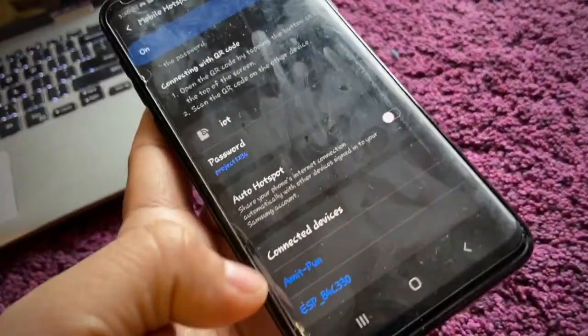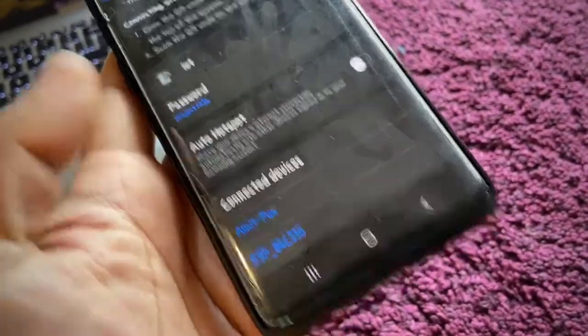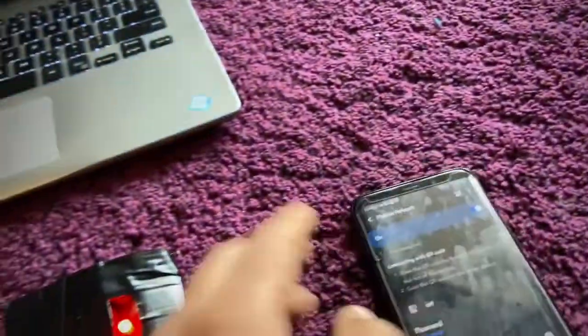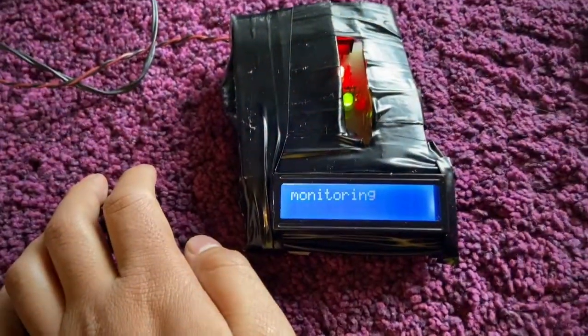These two devices - one is Amitpun, that's my laptop, and the other one is this device. So now it's monitoring.